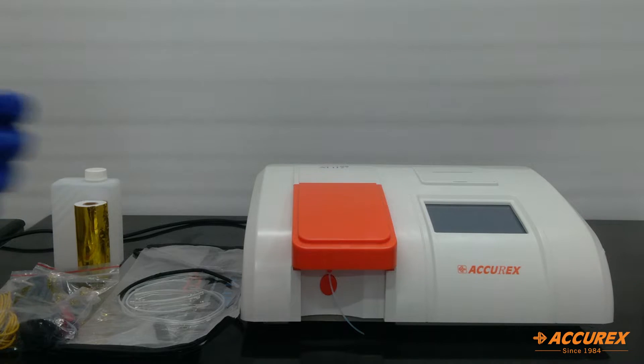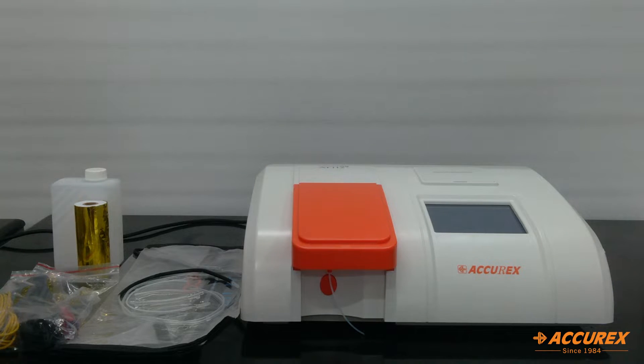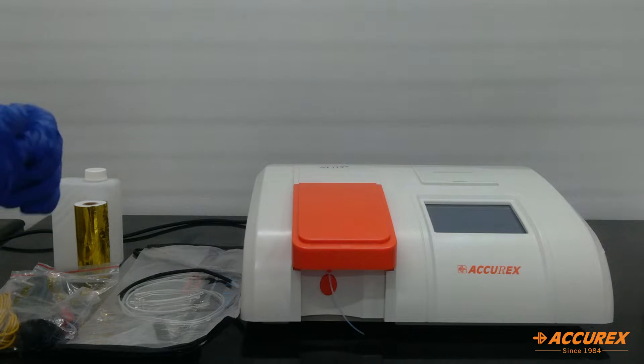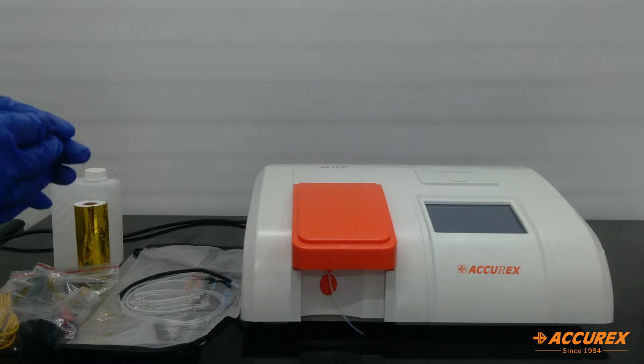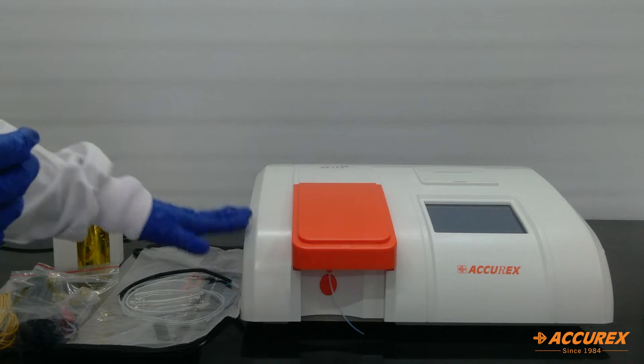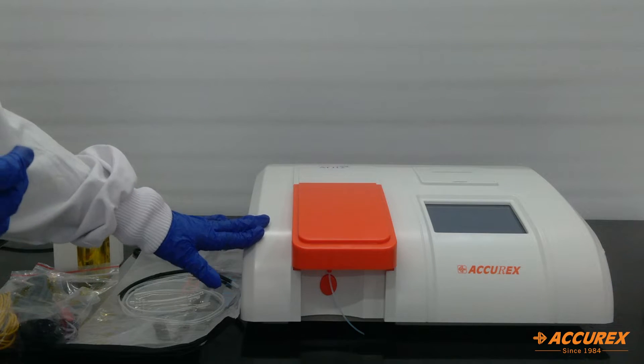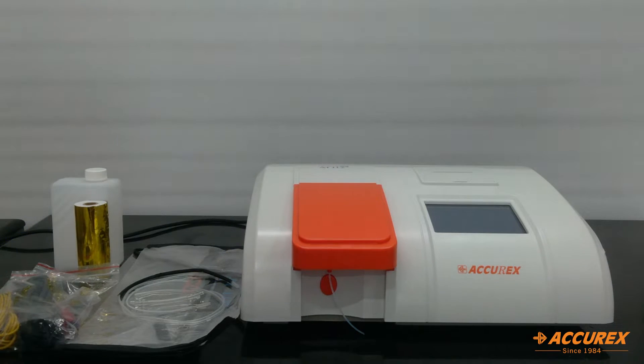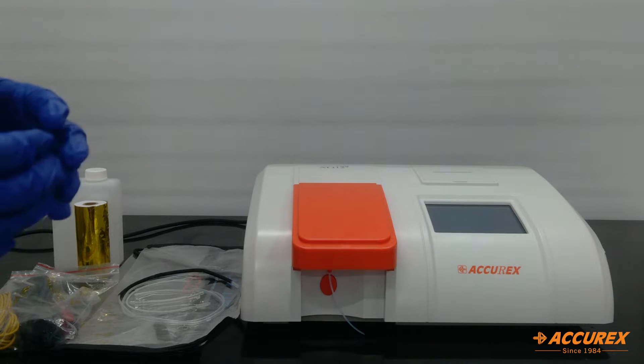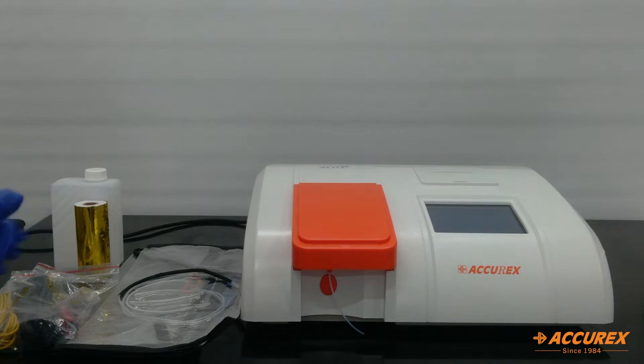Hello everyone, greetings of the day. Today we will see Acurex semi-auto biochemistry analyzer that is AT112+. So first we will see all the accessories that come with the analyzer.